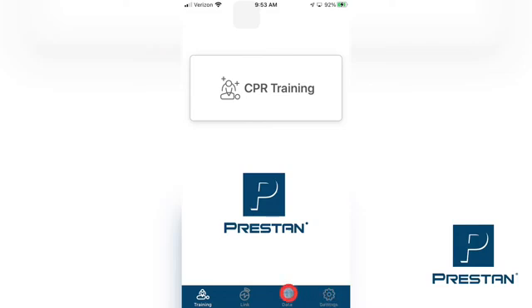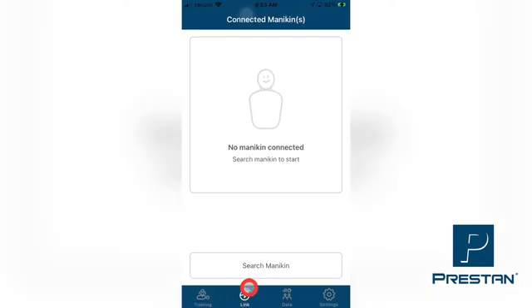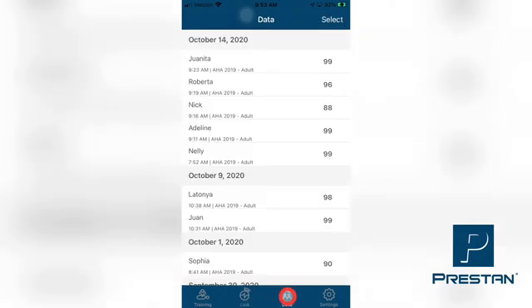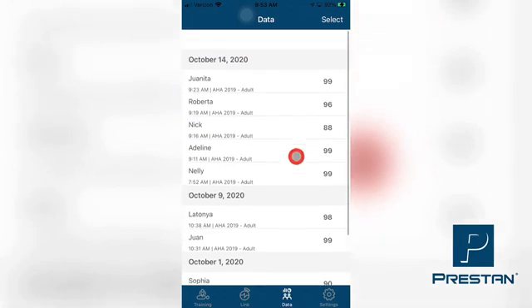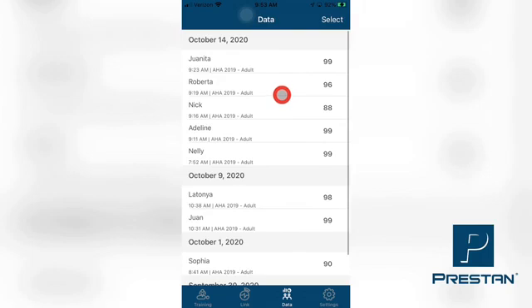Overview Guide: The Training tab and the Settings tab. The Training tab allows the instructor to monitor the training of up to six mannequins per device in real-time. The Link tab will allow the instructor to connect to and manage all of your mannequins. The Data tab allows for the access and review of any historical training data that has been completed and captured using your smart device.